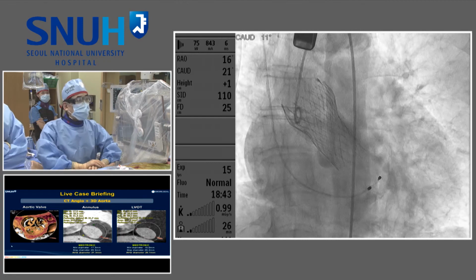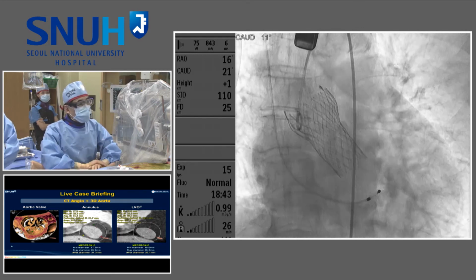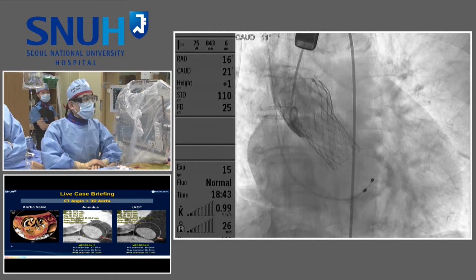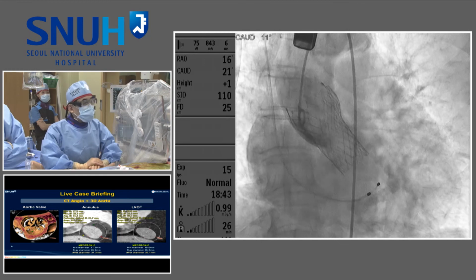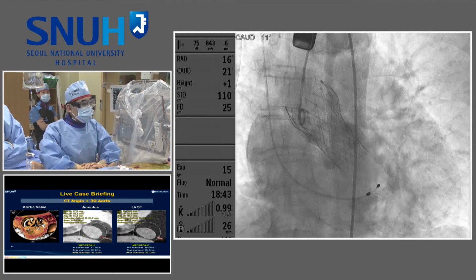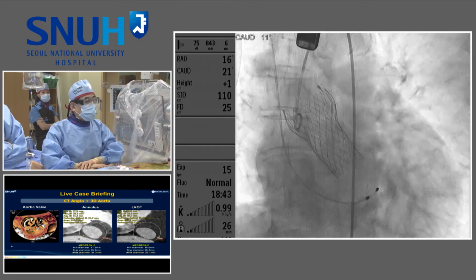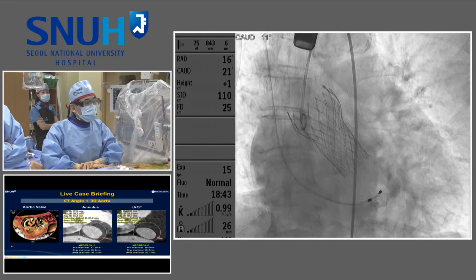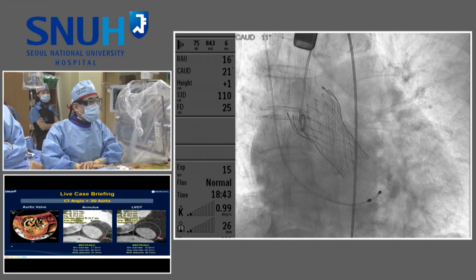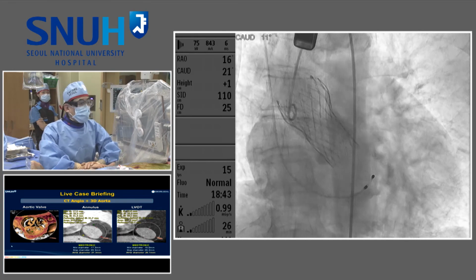Thus, my plan is always to keep the patient overnight in the CCU with the pacing catheter in place from the right jugular vein. Then if it is okay, we remove the pacing catheter at noon tomorrow. But if there is a transient complete AV block, we wait 3 more days. If there is then a change to complete AV block or LBBB, we implant a permanent pacemaker. If there is no transient AV block, we remove the whole system and wait for ECG changes for an additional 7 days in the general ward. If it's okay, we always discharge the patient. Thus, in terms of conduction delay, we are really conservative.